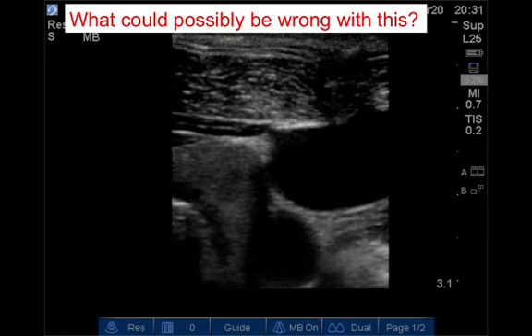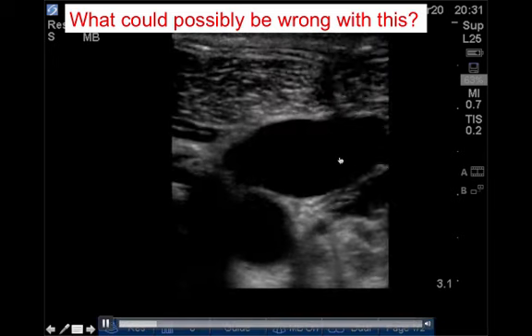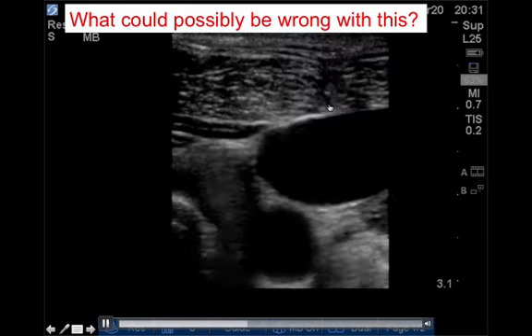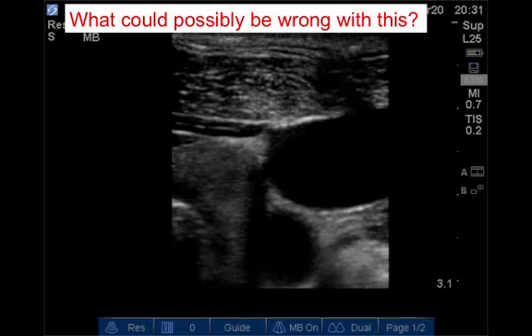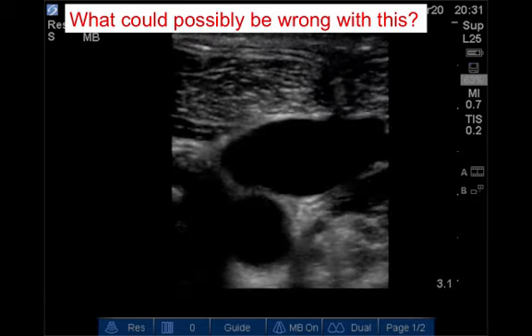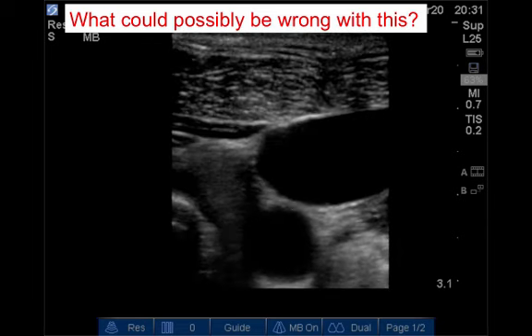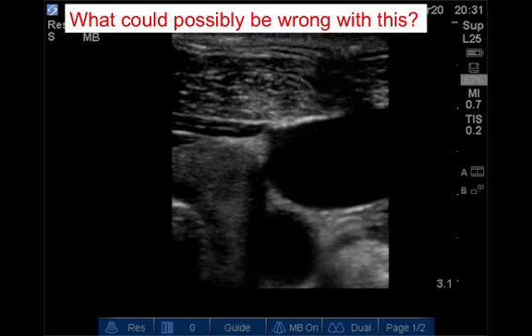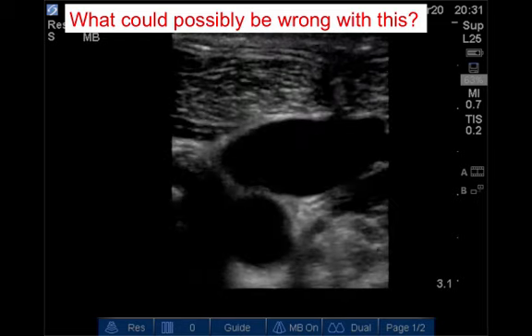So I expect many of you have done ultrasound guided access, and I think it's important to recognize that many of you, I expect, will have done it in this approach, where you have a nice image of the carotid and the IJ here, and you can see tissue wiggling, but you see either no evidence of needle tip, as is in this case, or often what you might mistake for the tip that is not actually the tip. And that comes back to the creep technique, which we'll talk about in a little bit. So I would argue that this is not a satisfactory approach to vascular access, and that if this were my loved one, I would like you to know exactly where the piece of metal you are using to pierce the flesh and blood vessels is located, rather than simply relying on the trajectory that you can infer from this ultrasound-guided image.